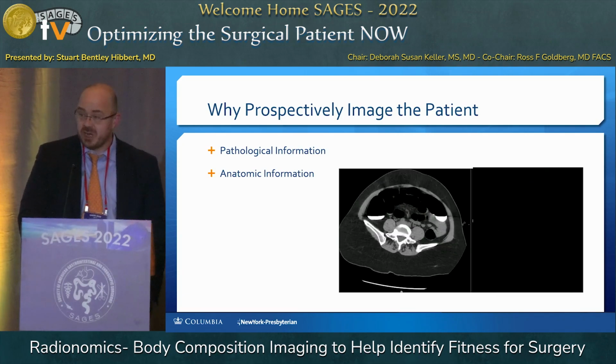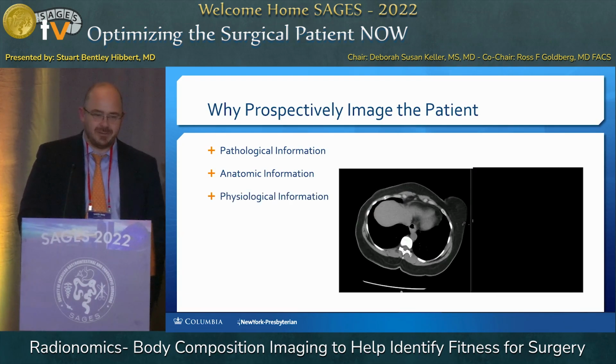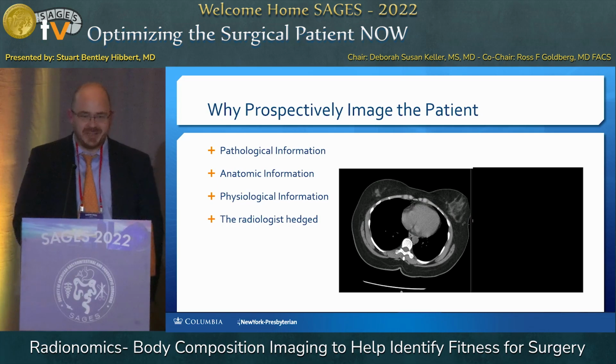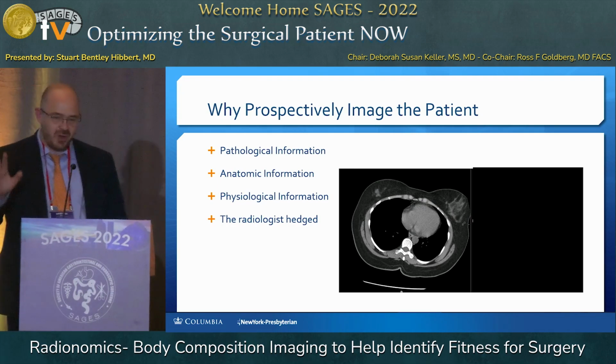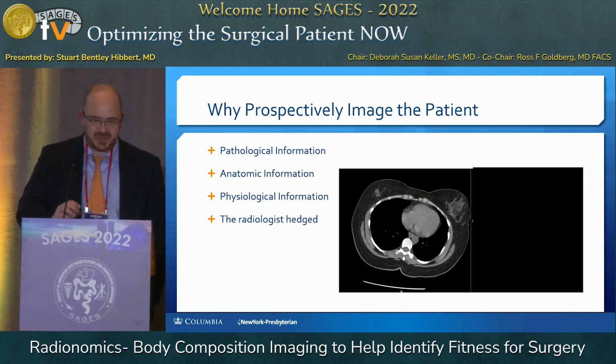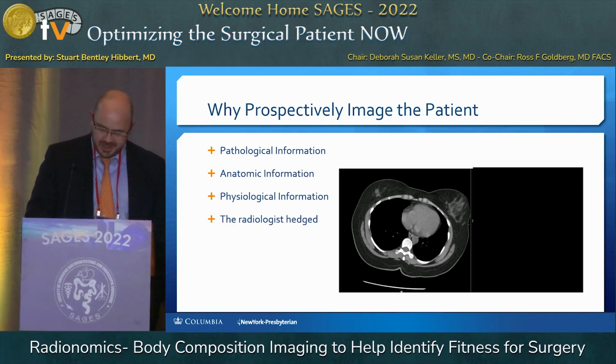We do it for pathological information. We do it for anatomic information. We do it for physiologic information. And let's be honest, we did it because radiology hedged. I don't use the word equivocal. I would not use clinically correlate. I would not say consistent with. I will tell you what it is. At least at Columbia, that's what we try to do.